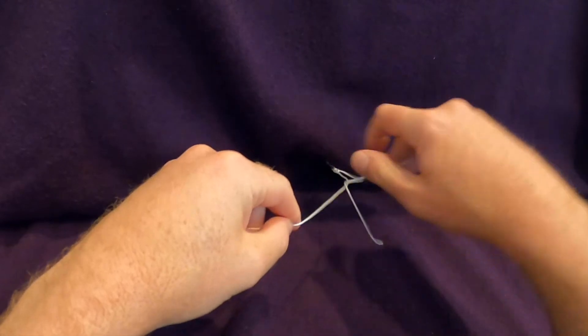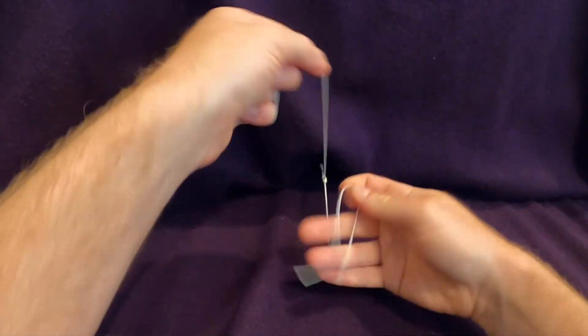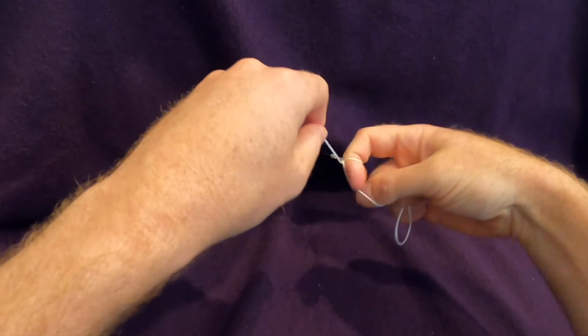Let's watch a few throws in normal speed here so you can get a general idea of the feel of this technique. Right now we're performing right hand knots.